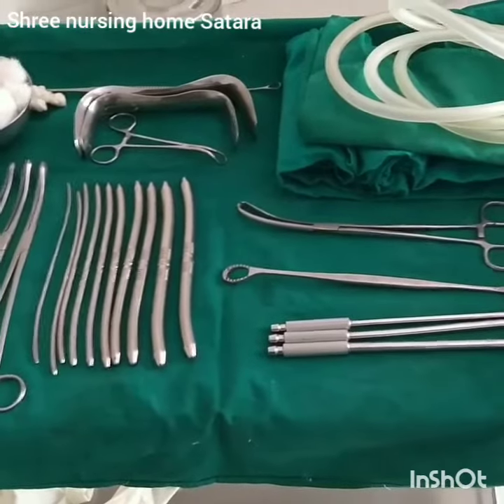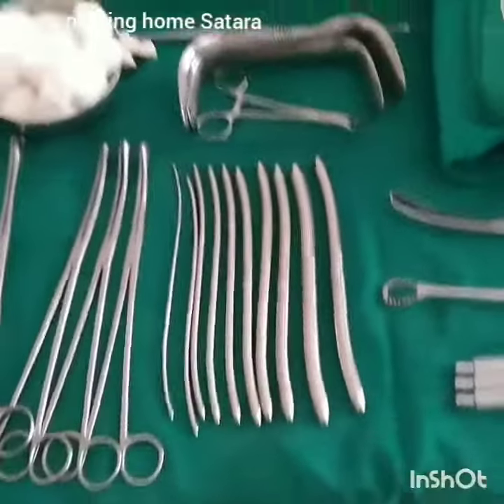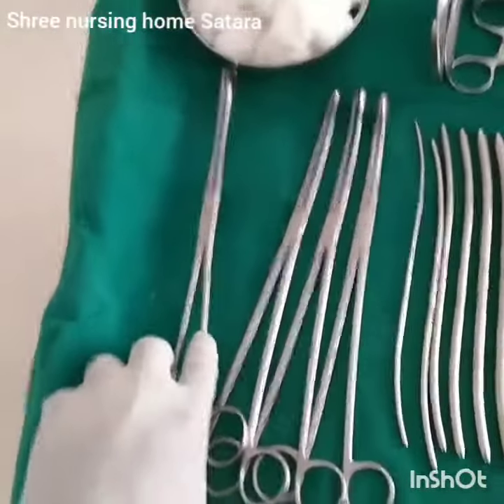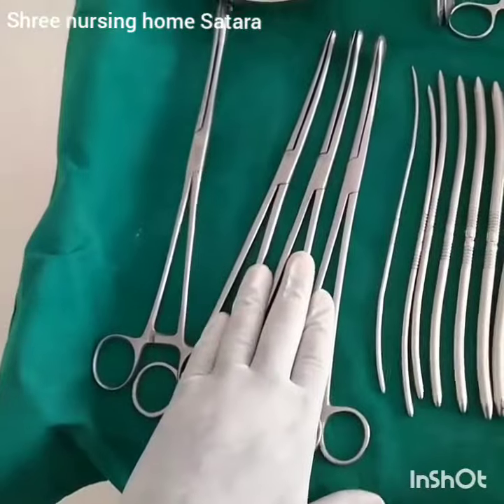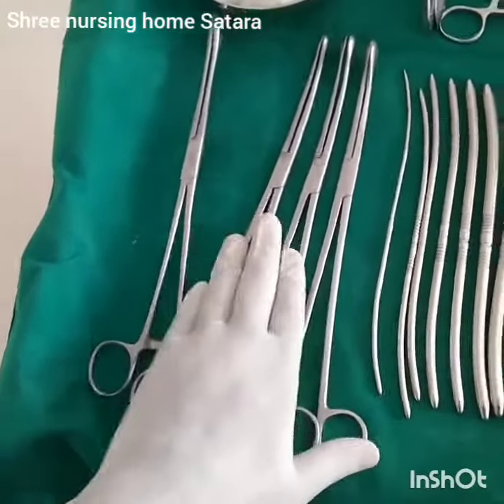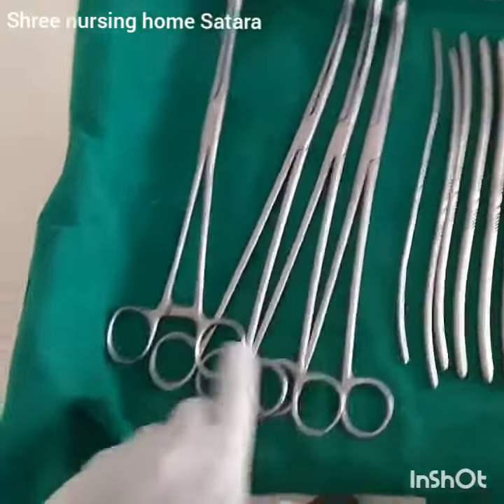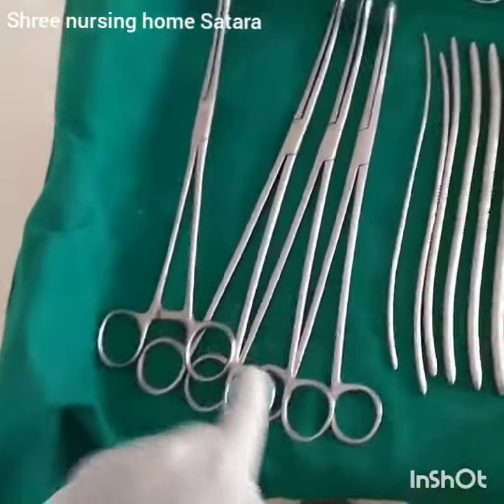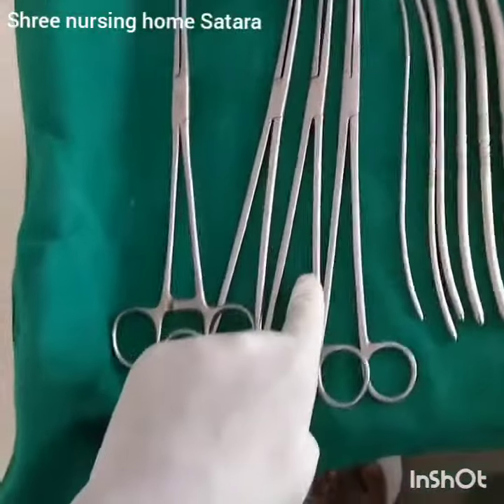This is my D&C trolley. Let's see what's included in it. First one is sponge holding forceps. Next to sponge holding forceps, there are ovum forceps with a number of sizes. The clear difference between sponge holding forceps and ovum forceps: there is a catch in sponge holding forceps, there is no catch in ovum forceps.